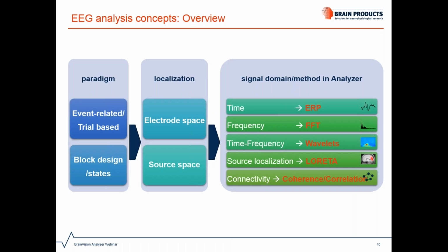All these questions we try to put in a simplified flowchart, which I would like to go through with you. I would like to introduce some ideas about experimental paradigms, what to consider for electrode space or source space analysis, and the different methods for different kinds of signal domains. For each method, I will talk about the motivation for why doing it, what it actually is, and what the result will be.